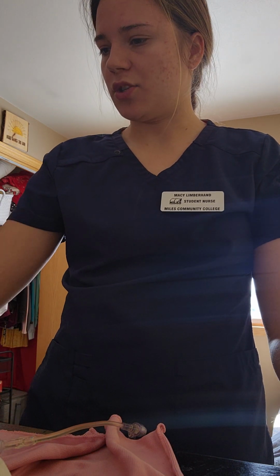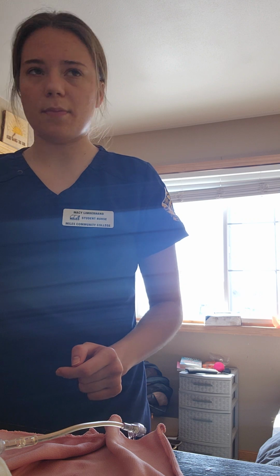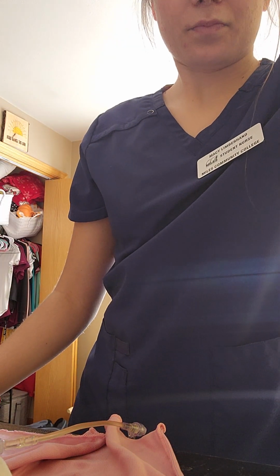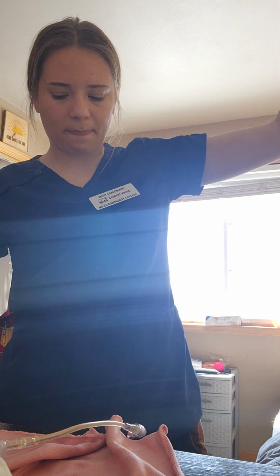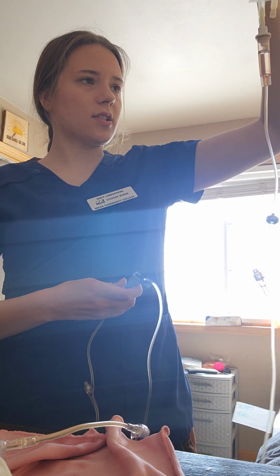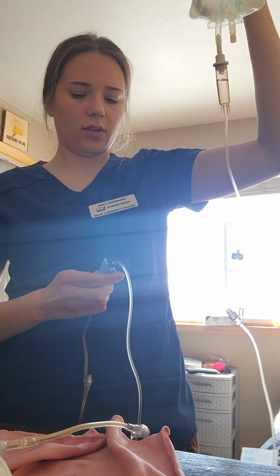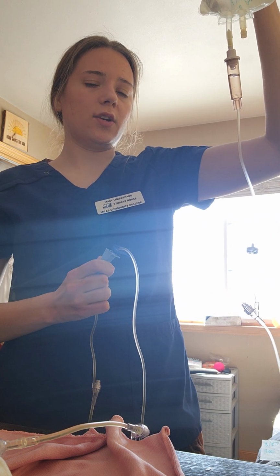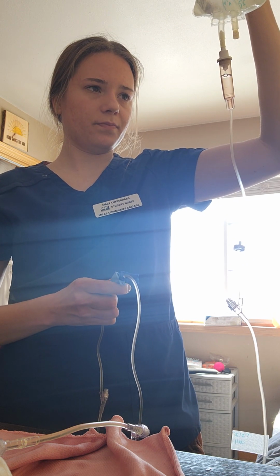And then I need to reset my primary IV to 28 drops per minute. So I'm going to take my primary IV bag, and I'm going to set it the same way that I did with the antibiotics. So I'm going to set a timer and just count the drops.